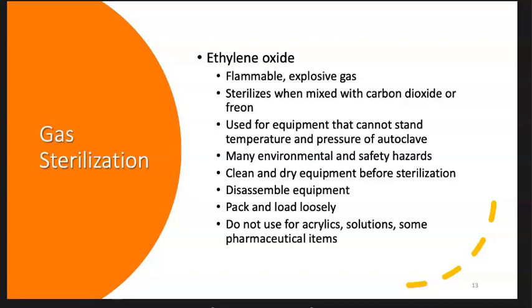This sterilization method has criteria that have to be met prior to sterilizing. No equipment to be sterilized can be wet with water, as ethylene oxide cannot penetrate water. Endoscopes or fragile material that cannot withstand heat and temperature are often sterilized using this method.